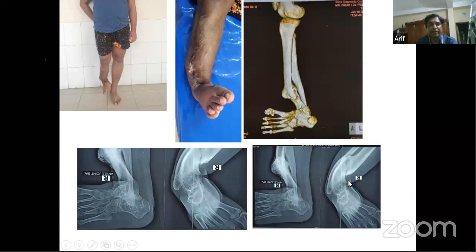This is a very bad condition, a childhood condition, and this patient is a medical student with this type of deformity and LLD. Sometimes the X-ray department does not have good X-rays, so you cannot visualize all the components of the deformity. And I want to see here there is a very big bony bump. What is in this bump? Is there any non-union or hypertrophic union or other things?